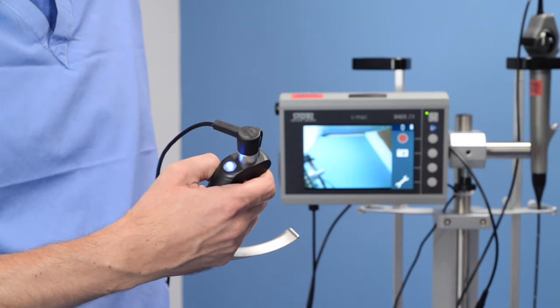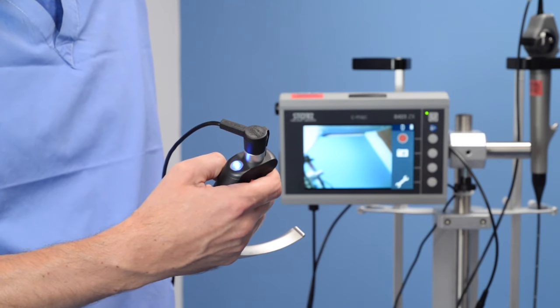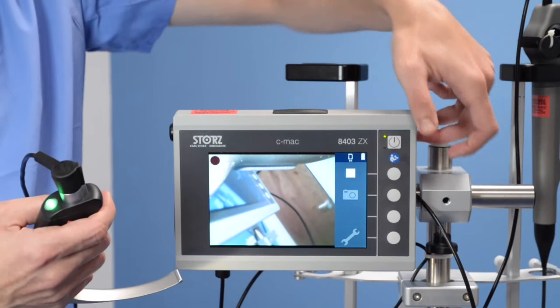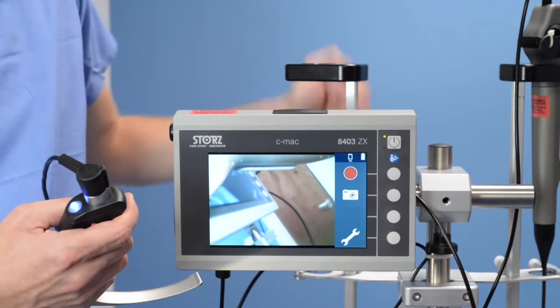The CMAC video laryngoscope allows the user to take pictures. This can be activated by this blue button here, or on the main screen by a separate user.